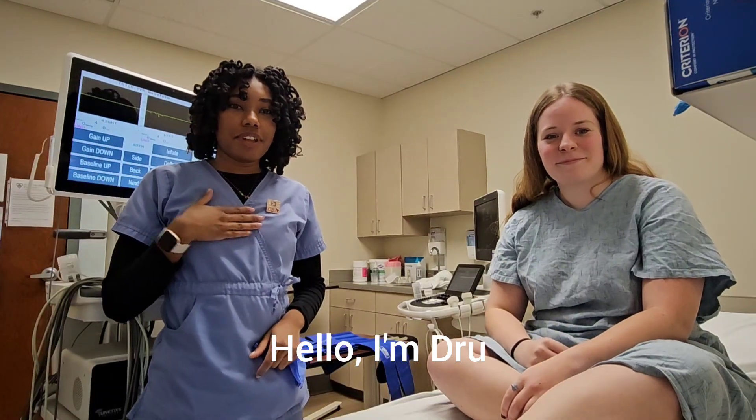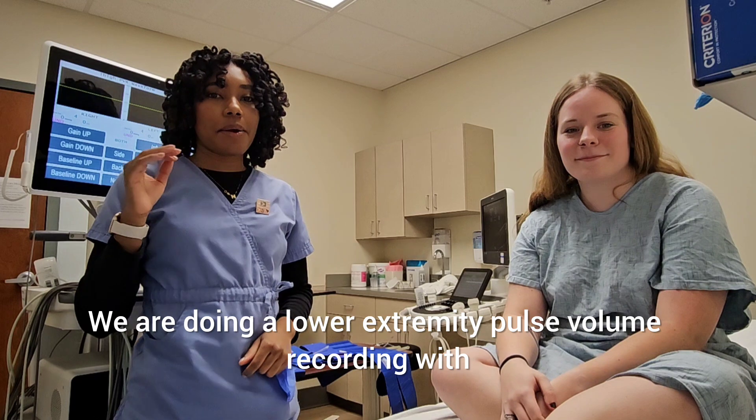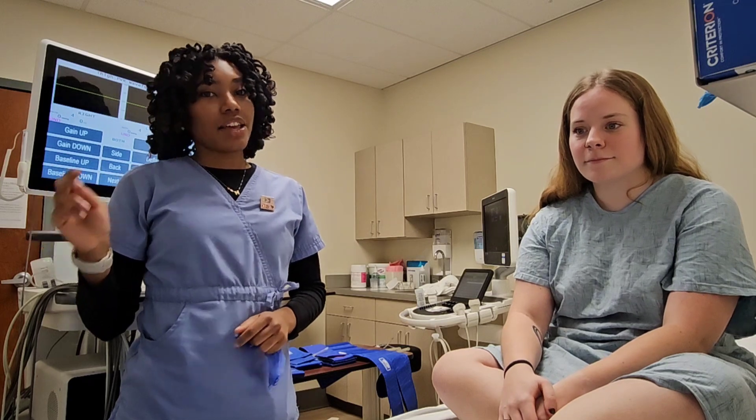Hello, I'm Drew. This is Skye. We are doing a lower extremity pulse volume recording with ABI exam today — ankle brachial index. Let's get started.